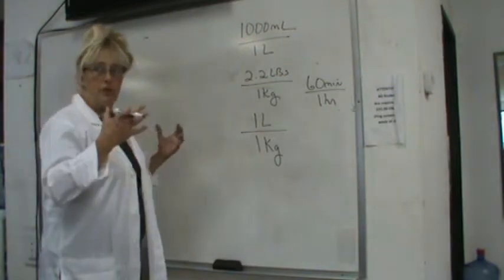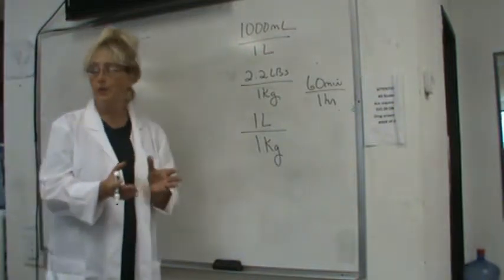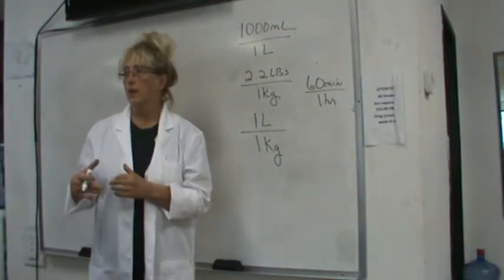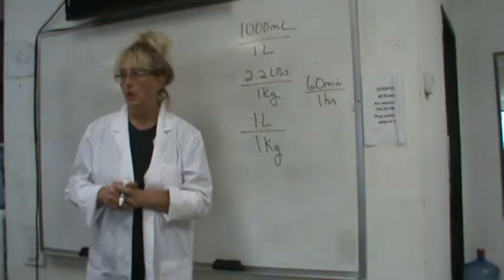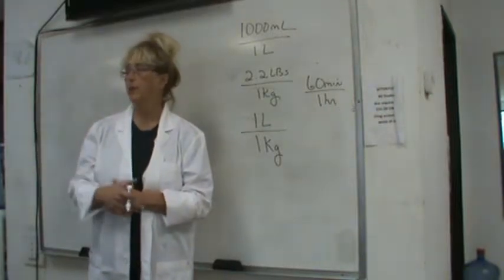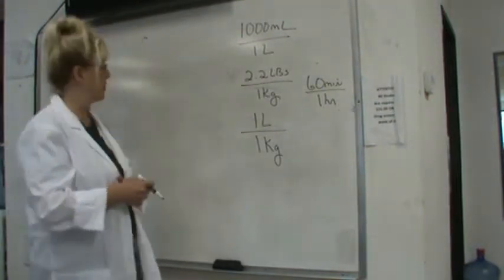So, as a new medical assistant, you come onto the doctor's office. He's already got a patient sitting in the chair. This patient's been in the chair now for about an hour. We are infusing approximately 750 mLs of, let's say, a solution that this person needs. Say it's an electrolytic solution.